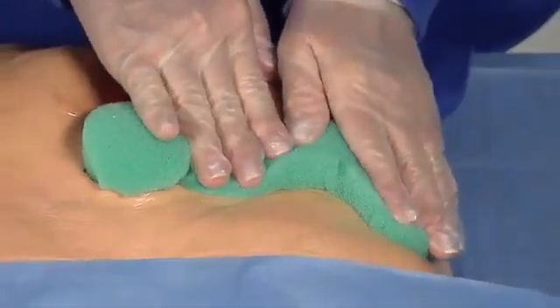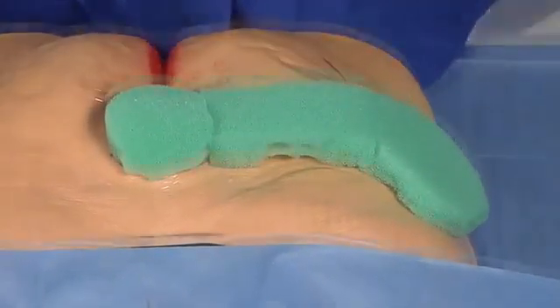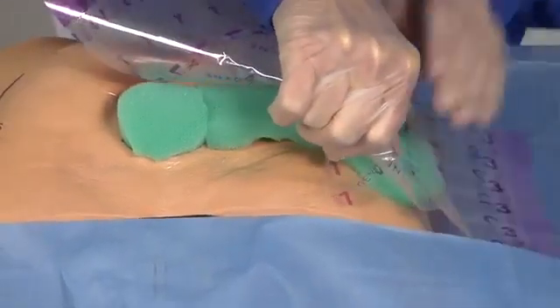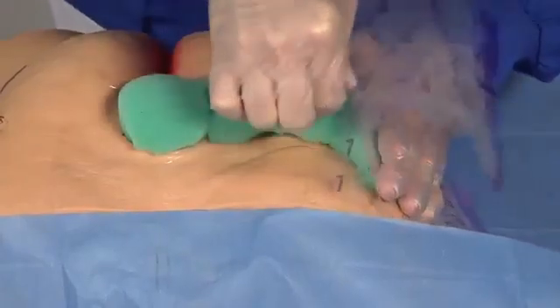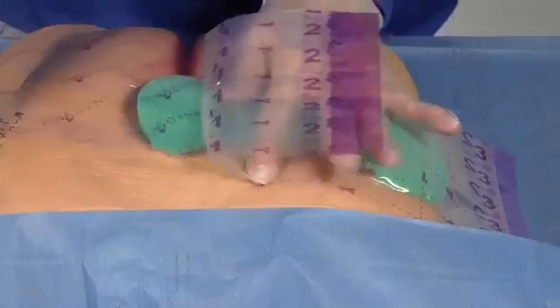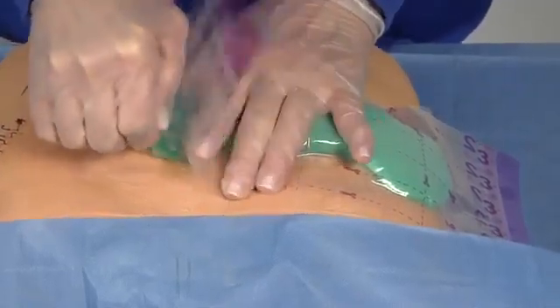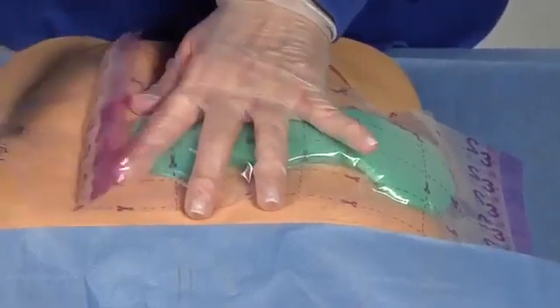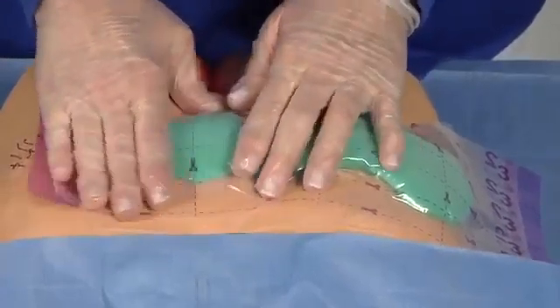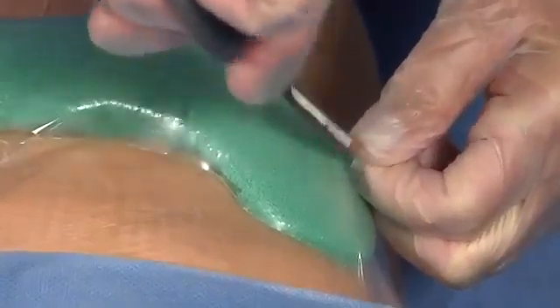Run a piece of bridge foam from the main wound bed and apply the transparent film over the entire bridge. At the end point, cut your port site and apply the port dressing.